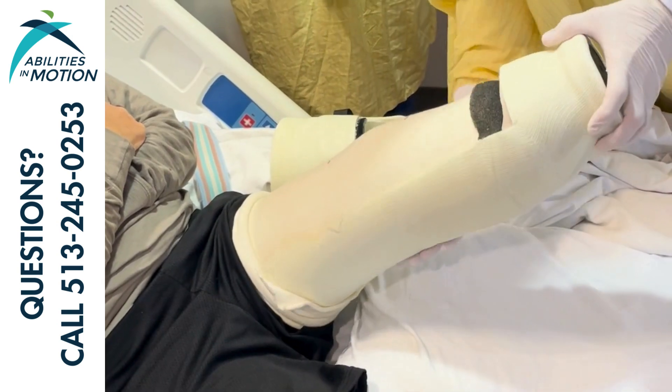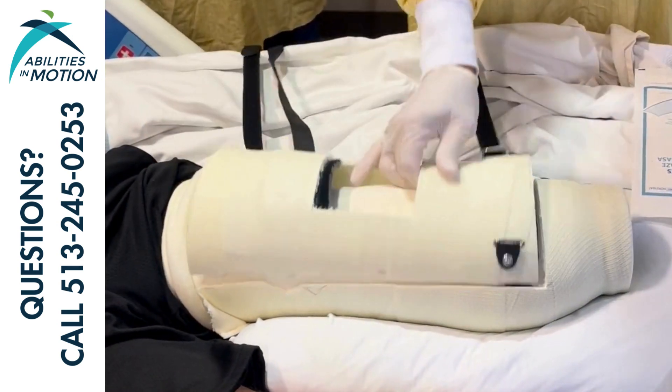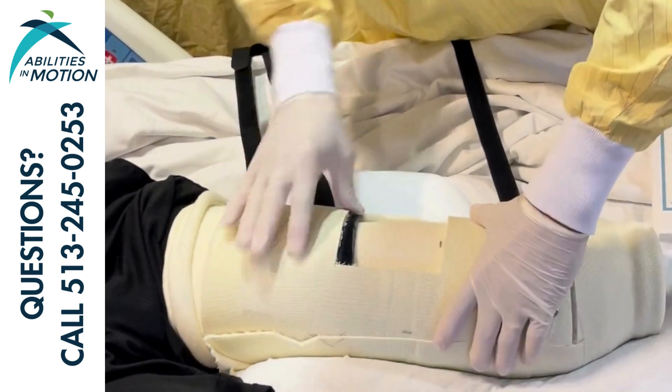That's a common error that we see in reapplication of the cast — that there is a gap left between the bottom of the patient's limb and the base of the cast.